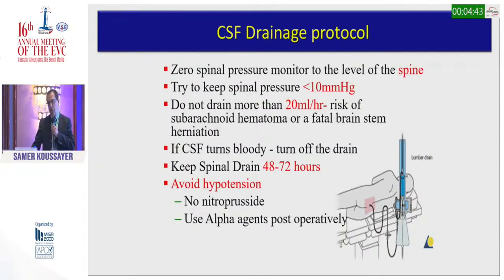This is a very important protocol. When you send the patient to the ICU, it's very important to give this protocol to the ICU team. You need to zero the spinal pressure monitor to the level of the spine, because ICU people are used to leveling all the lines to the level of the heart.